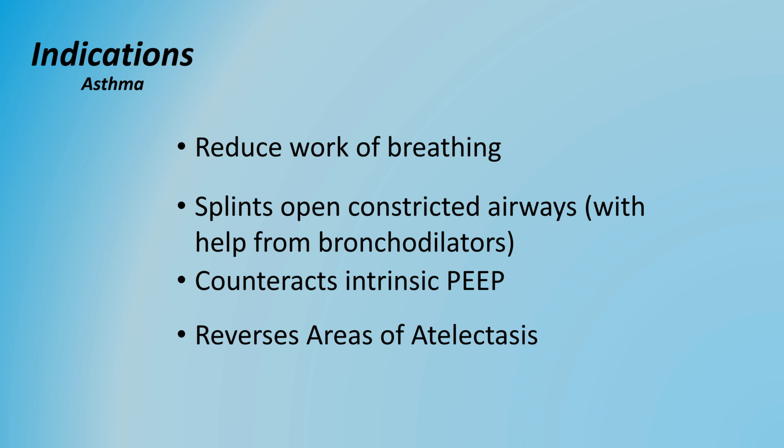Next, CPAP is going to reverse areas of atelectasis. As a reminder, atelectasis is the collapsing of the alveoli that can occur for many reasons. The extrinsic PEEP produced by CPAP can re-recruit these collapsed alveoli, creating more surface area for gas exchange, which leads me to my next point. CPAP is going to help maintain gas exchange. The increased pressure that oxygen is being delivered at helps to ensure that some oxygen is still going to make it to the alveoli, even initially when the patient is still significantly air trapping.